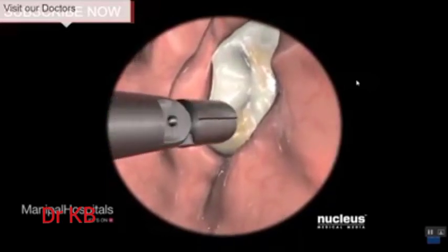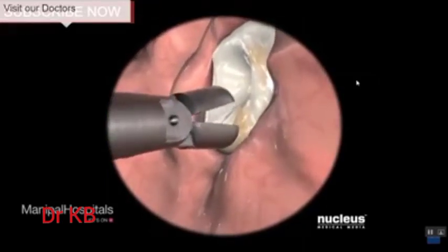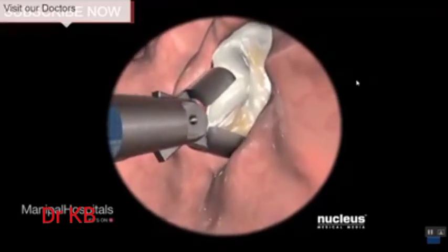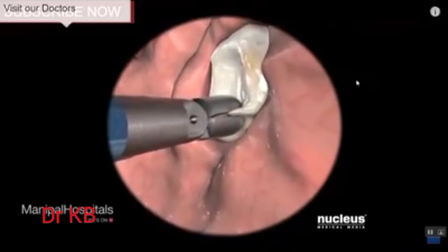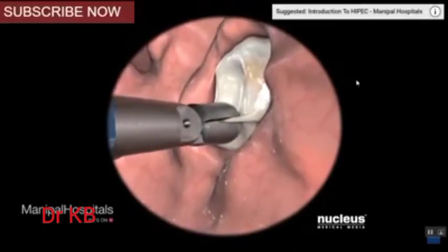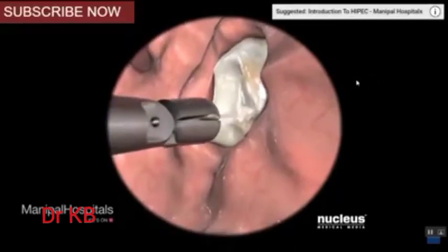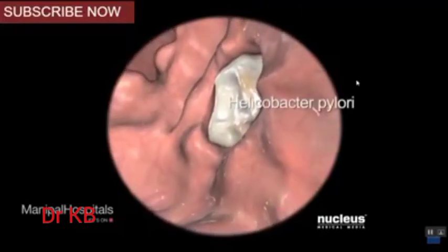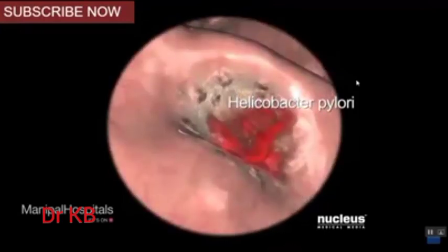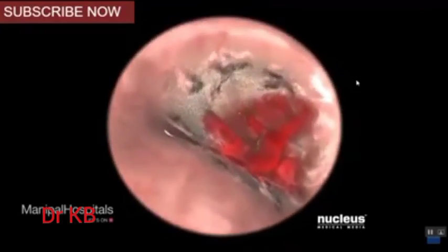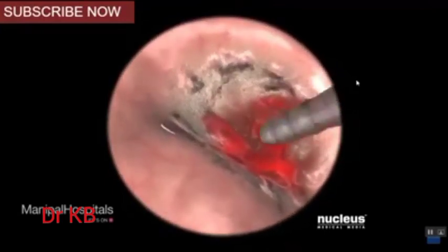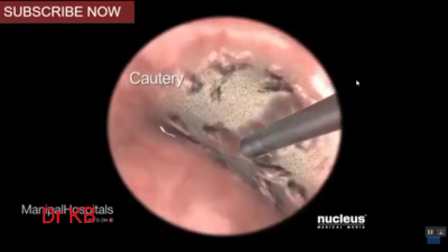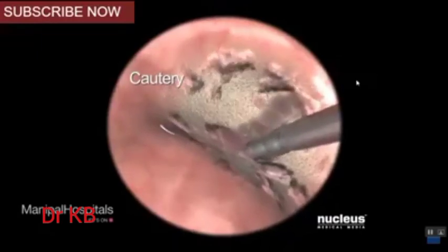Your doctor may periodically introduce a small amount of air to flatten the mucosal lining and improve visibility. If your doctor would like to collect a sample of tissue, he or she will obtain one or more biopsies through the endoscope for later examination. A biopsy will help distinguish between benign and cancerous tissues. It is also used to detect Helicobacter pylori, the bacterium that may lead to ulcers. Your doctor may also use the endoscope to treat a problem such as an actively bleeding ulcer or to stretch open a stricture or narrowing in the esophagus or stomach.